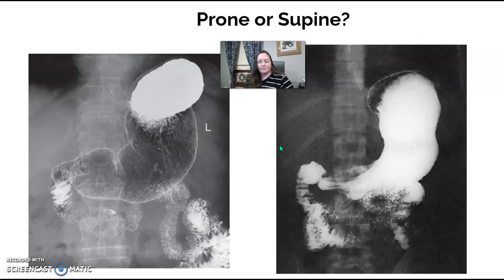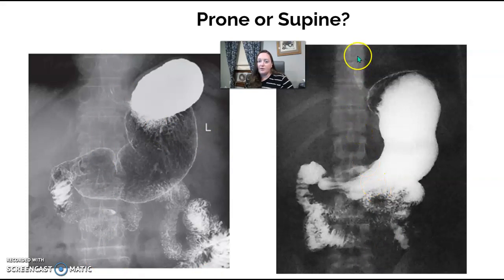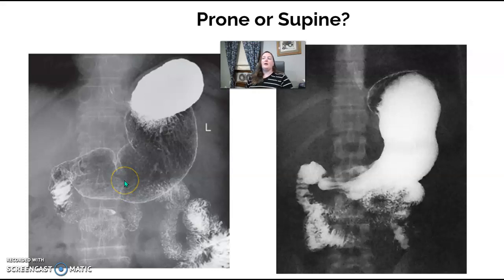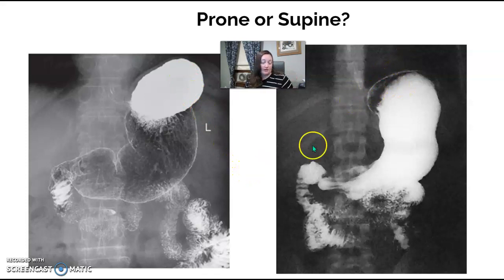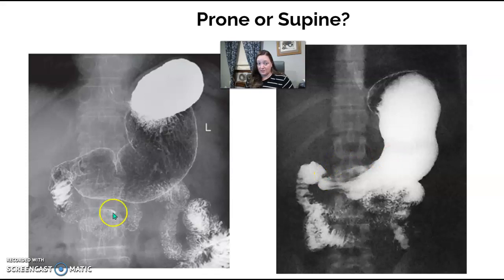Prone or supine? Look at the spine — spinous processes are coming straight down the midline on both, so this patient is either supine or prone. If they're supine, barium goes into the fundus as the lowest point. If prone, air rises into the fundus. So the image with air in the fundus has to be the prone.